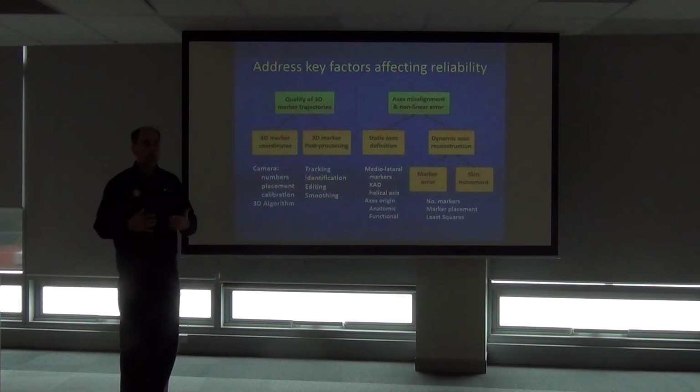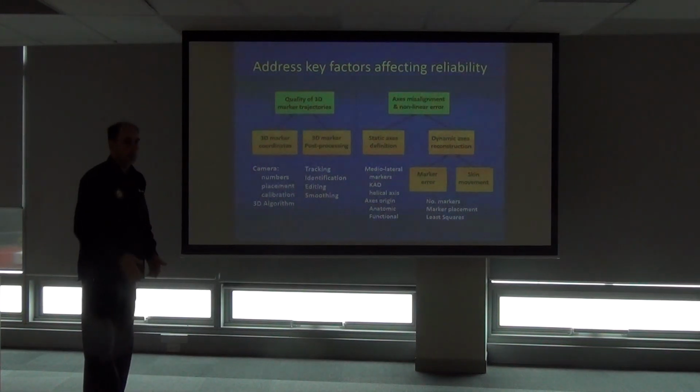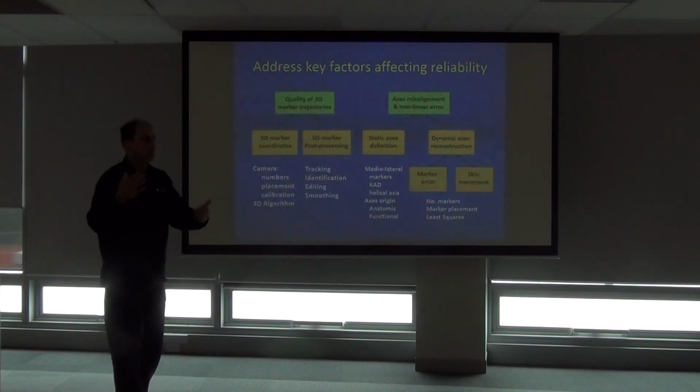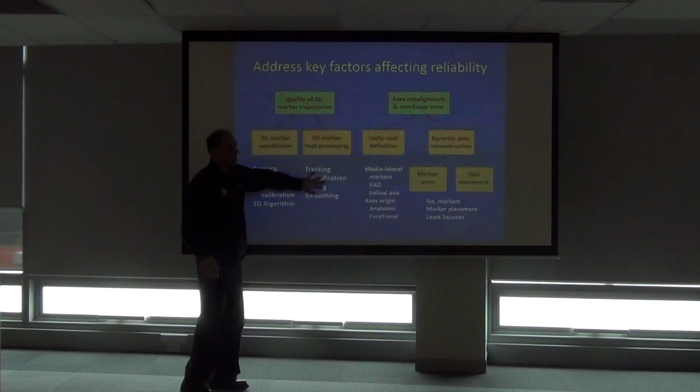intra-session reliability, getting different or unrelated gait patterns of someone walking up and down within a gait session. Same marker set, walking up and down, presenting results which represent unrelated gait patterns. We're really going to take a look at this.